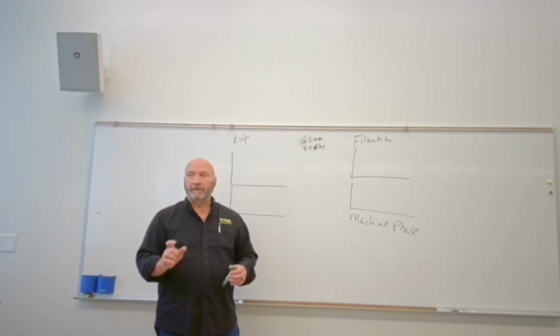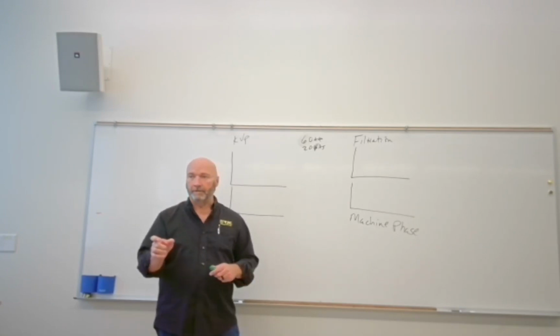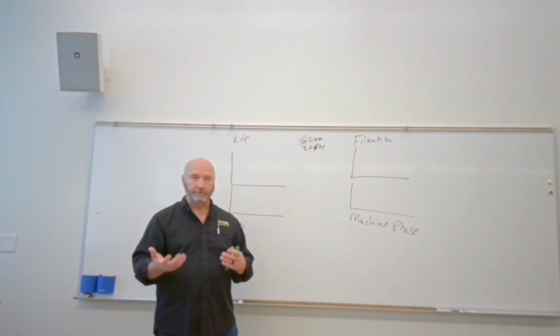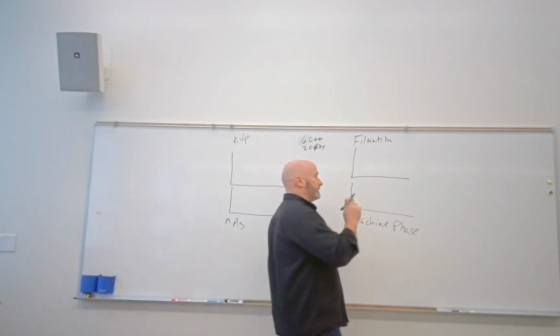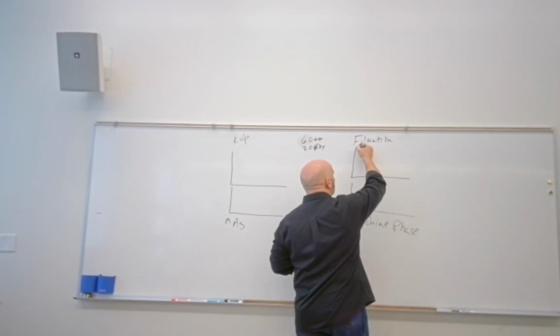And what we're most interested in is what comes through just the port. It eventually goes through your collimator housing, and that becomes your primary beam. So at the anode, your Brems spectrum actually looks like this.